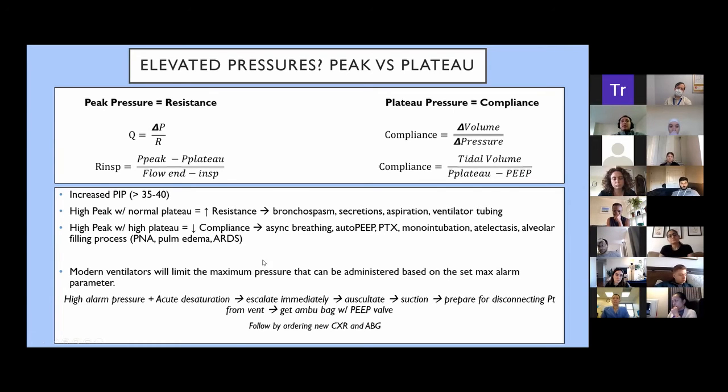The reason we always tell you to be mindful of this is that for ARDS, one of our treatment goals is always to have a plateau less than 30. So if you are setting up ventilatory parameters for a patient and you're providing a tidal volume that gives a very high plateau, you're damaging that patient. Similarly in the CCU, you have a patient with cardiogenic pulmonary edema, and the patient's lungs are completely fluffy. You set up a tidal volume of 8 cc per kilogram because the patient is hypercapnic and you want to help the CO2, but that's providing a plateau of 45, then you're injuring that patient. So you have to be mindful of that when you're setting up parameters for the ventilator.